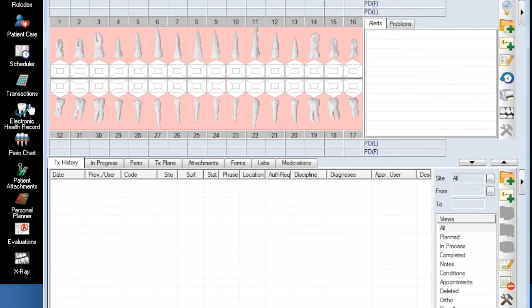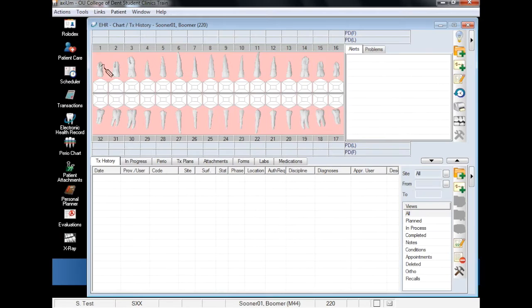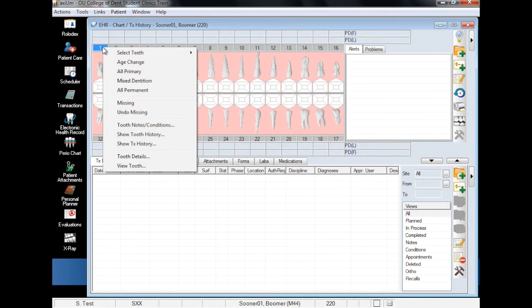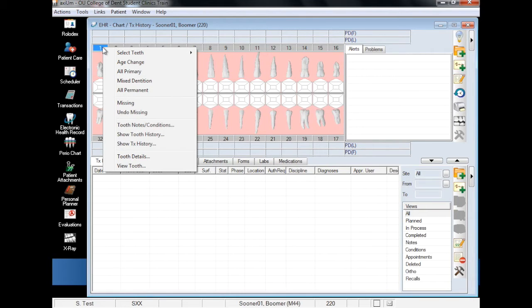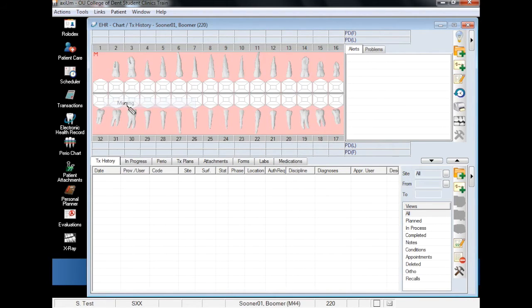The first findings we will add are missing teeth. To mark a tooth as missing, click on the tooth number, then right-click to bring up the contextual menu. This is where you will mark the tooth missing. Note the red M under the missing tooth number.